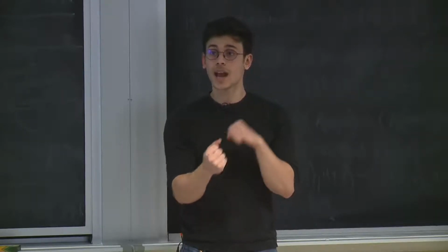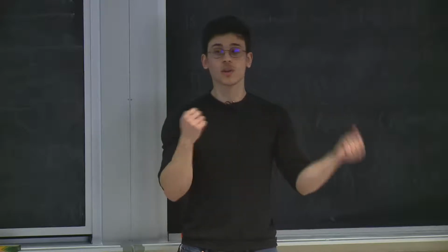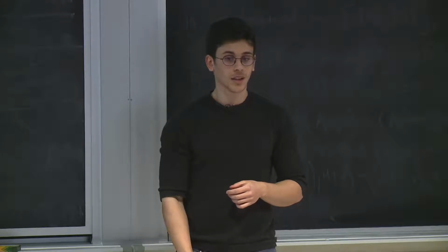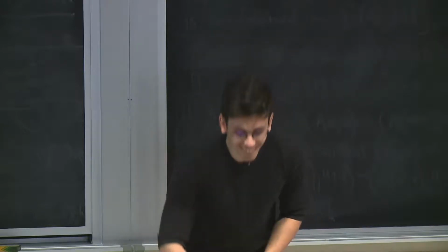But if you do things like average pooling, then any one thing that has a very high activation will get averaged down lower. So, for example, in our work, we use max pooling to get around that. Any other questions? If this is complicated, have no worries, because we actually think it's totally unnecessary, and this is the next slide. So good for you.